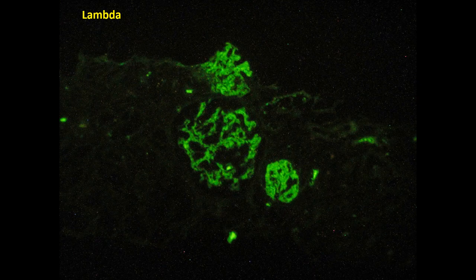So this pattern of positivity for polyclonal IgG is highly suspicious for fibrillary glomerulonephritis.